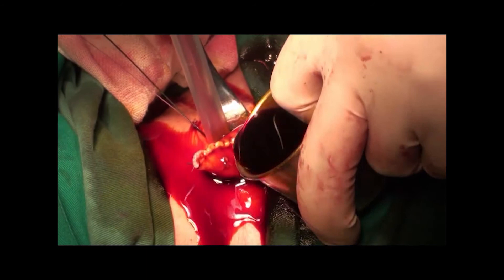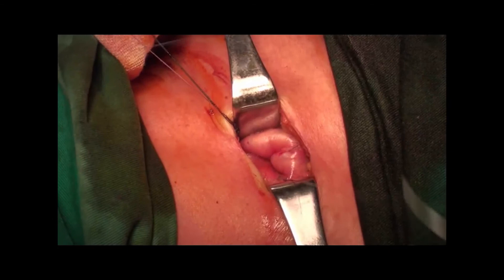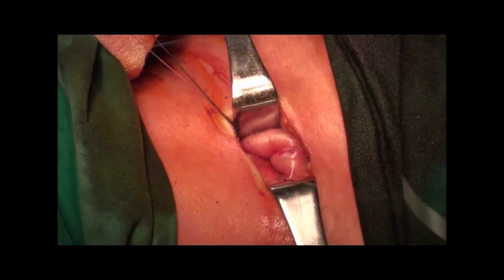Continuous 4-0 suture was used to reinforce the cutting edge. Disinfection was performed. The redundant gastric conduit was embedded into the gastric conduit cavity using forceps and fingers. A gastric wrap was created to prevent acid reflux.